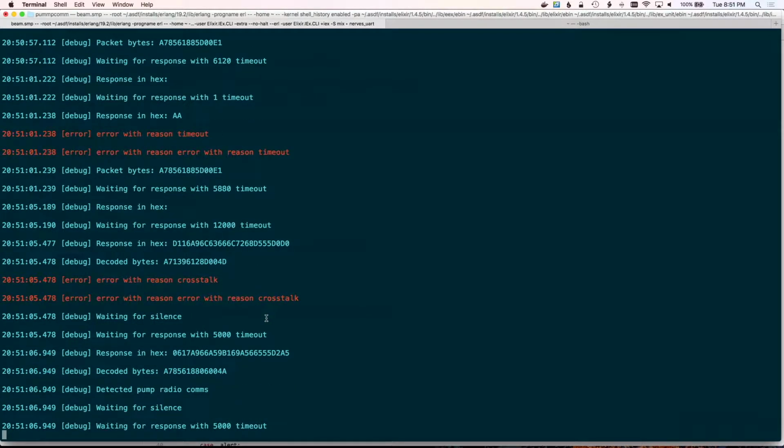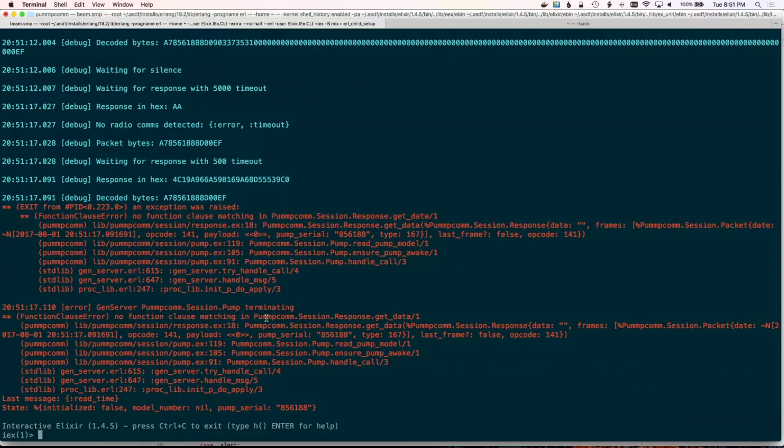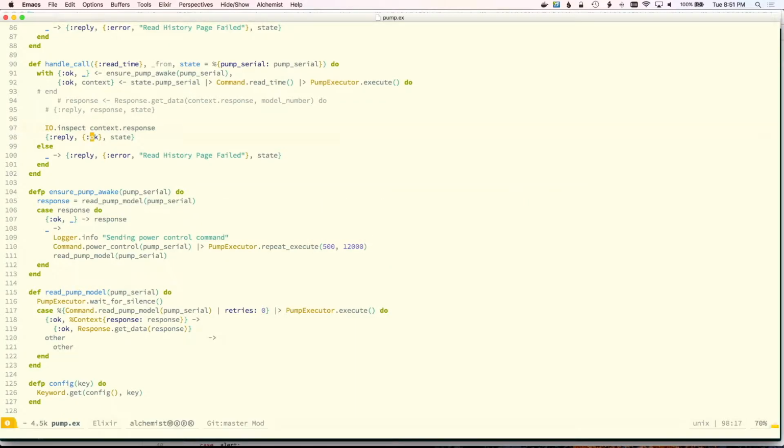Yep. That crosstalk means that there is another insulin pump in the room that somebody is talking to. And that's probably Amanda's upstairs. All right. So bad times. I thought that I didn't do the Response.get_data on this.